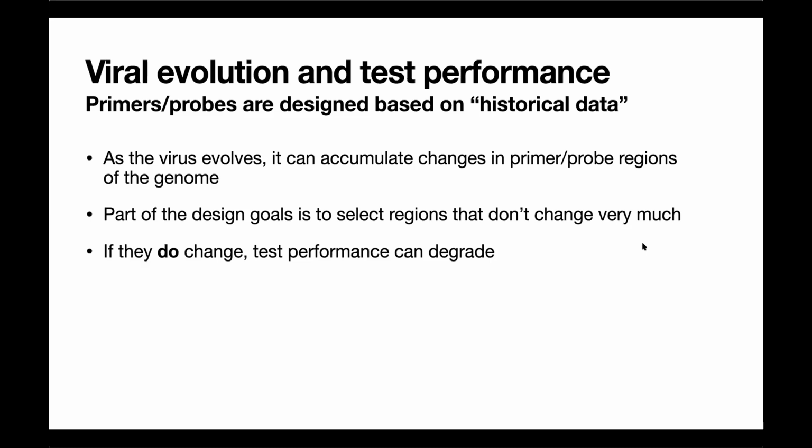So is there any evidence that the viruses in the past 6 to 7 months have actually fixed mutations in those primer or probe regions? So we can now do a confirmatory or follow-up study to evaluate whether or not the probes that the CDC and other public health agencies, universities and commercial entities selected early on in the epidemic, do they still work?